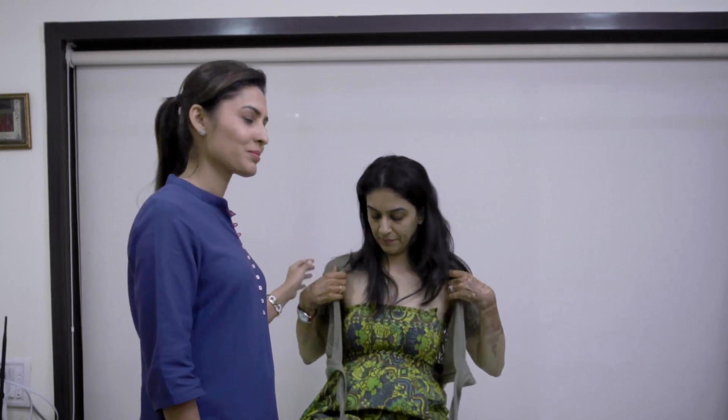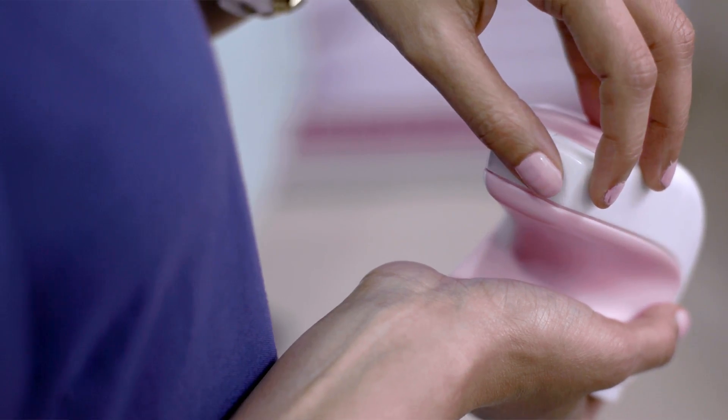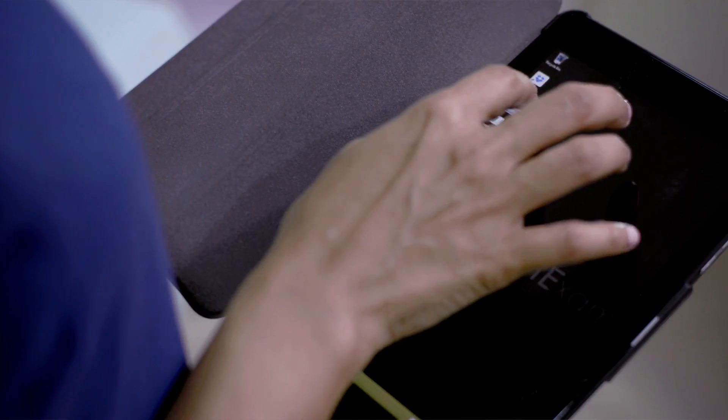The eye breast exam test is one of the easiest health checks you could have. During this test, you undress from the waist up and lie down on your back. The operator then connects the device wirelessly to a mobile phone.